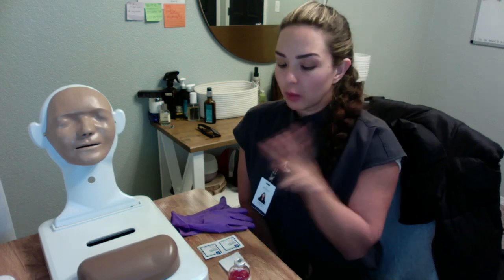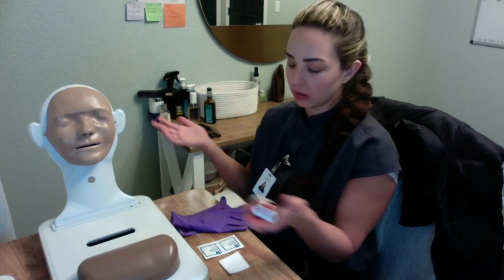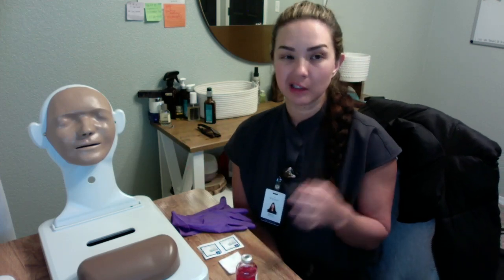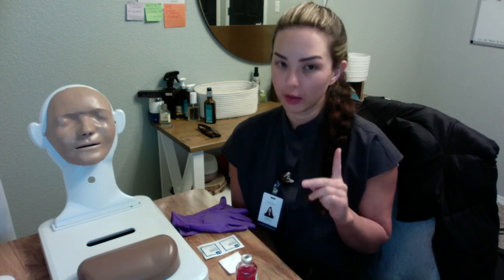After that, we want to go ahead and verify the medication order to the EHR or the MAR. So we've done that. We're good there. And again, it's going to be tuberculin purified protein, 0.1 ml, 1 dose.